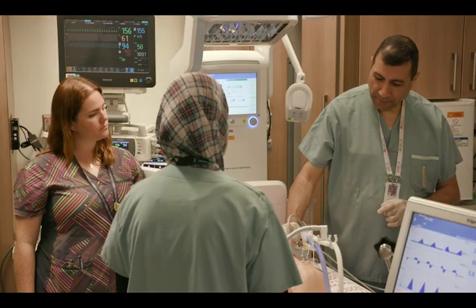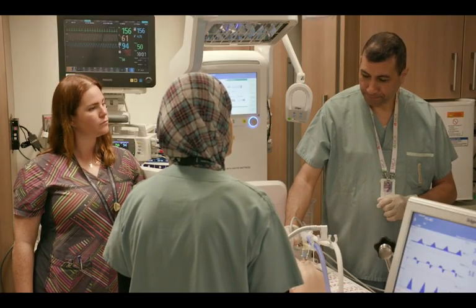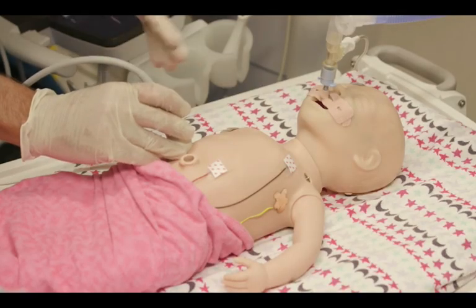I'm now evaluating the intestine, and I'm dividing the abdomen into 4 compartments.